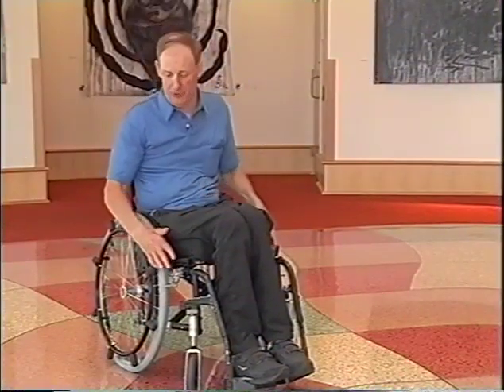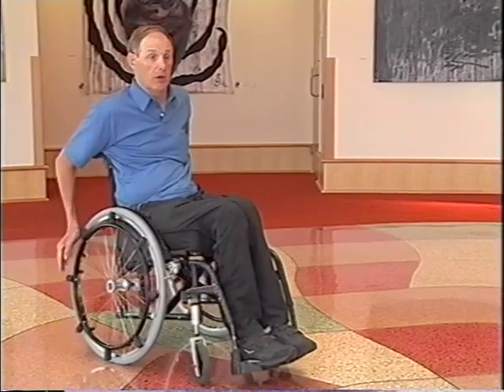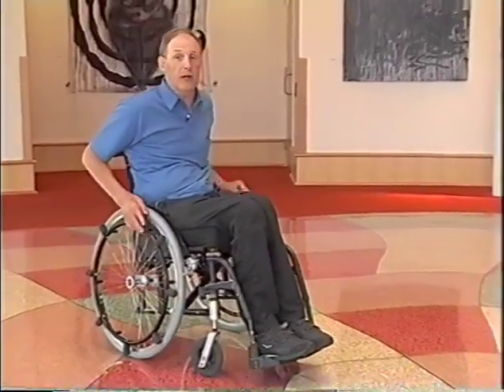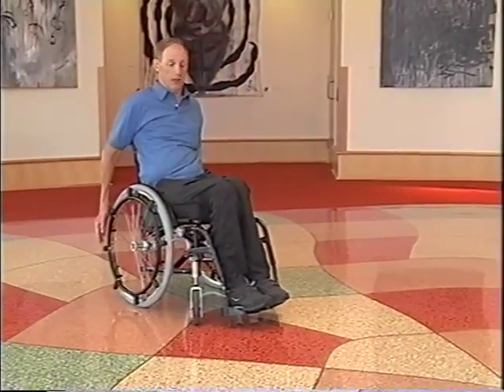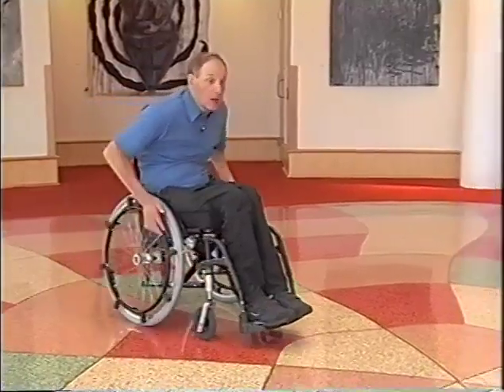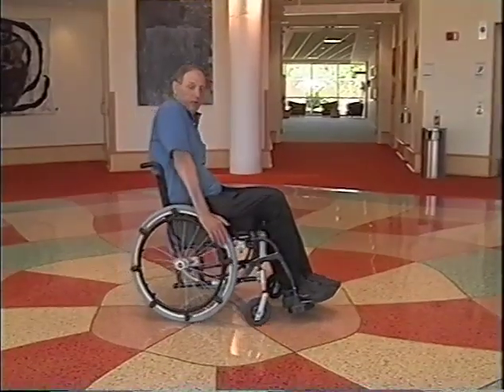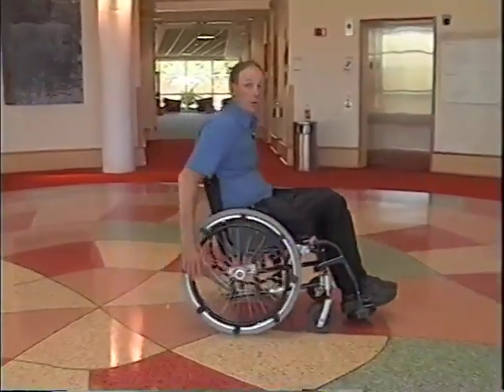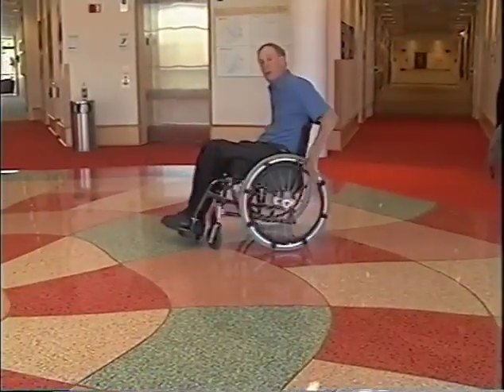Wheeling with projection is an art in itself. Basically, you want to do about the same thing that you're doing with the other things, that is starting with your head first and pulling your body forward. Now, since your biceps and your shoulders are your strongest assets, you want to try a few different techniques. One is pulling yourself forward and trying to supinate your shoulder as it comes down so you can drive and lock your elbow and drive with your shoulder.